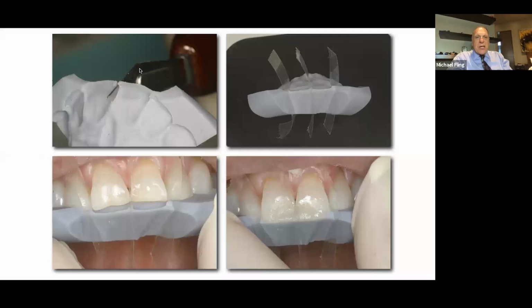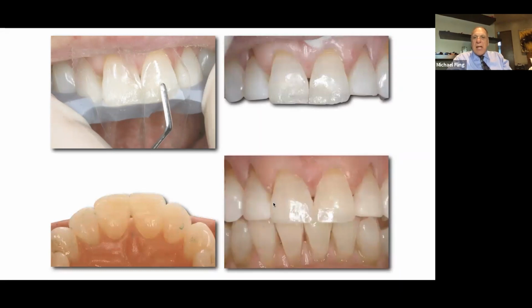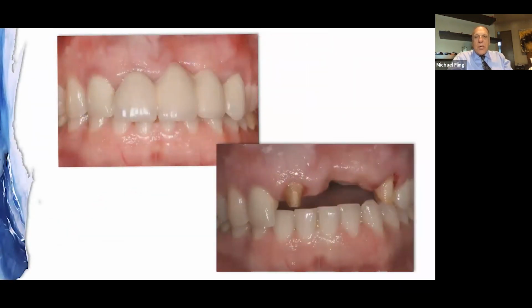Now notice I get a sharp scalpel and I cut through the interproximal here. Here you see my mylar. There's 1, there's 2, and there's 3. Now my interproximals are separated. I can now etch, prime, bond, start to lay my composite in. And now I've got an easy way to build up the shapes of these teeth, and my interproximals are open, and it makes that appointment go a lot quicker. So that's one of the techniques that I'll use.